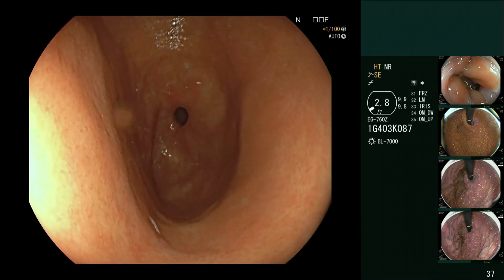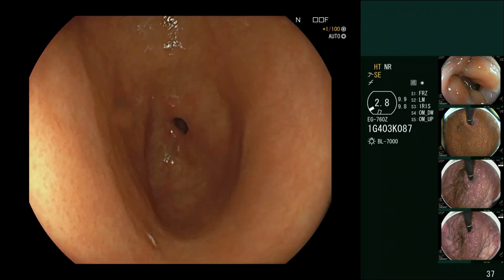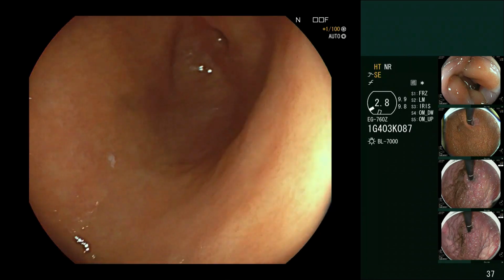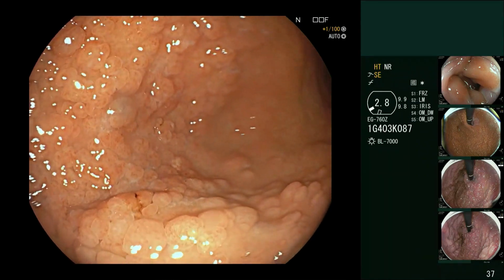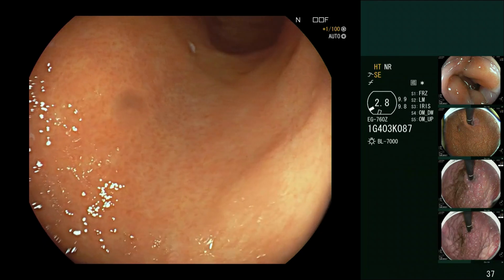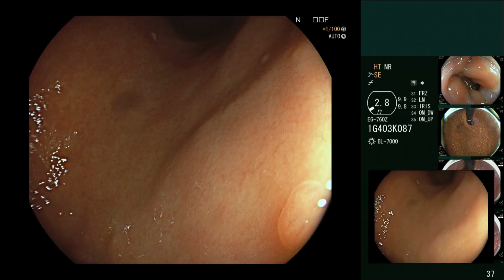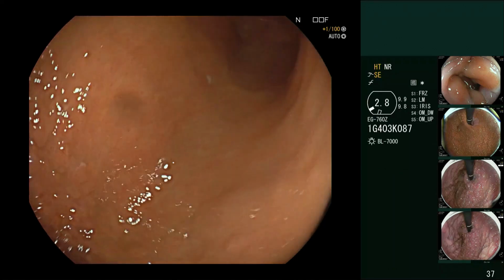So if the incisura is at 12 o'clock, then you can clearly describe things related to that in a clock face orientation around the pylorus. You can also say that 9 o'clock in this image is the greater curve. If I want to describe something, the imperfection on the image is quite useful because I can use it as a pointer. So where that imperfection is, this is the greater curve antrum junction, for example.